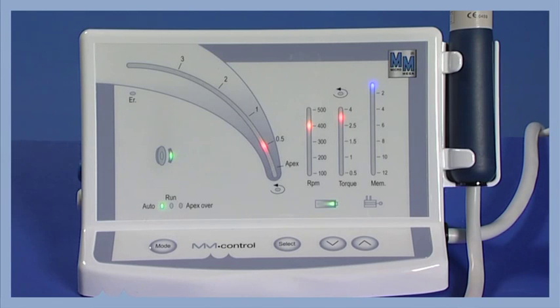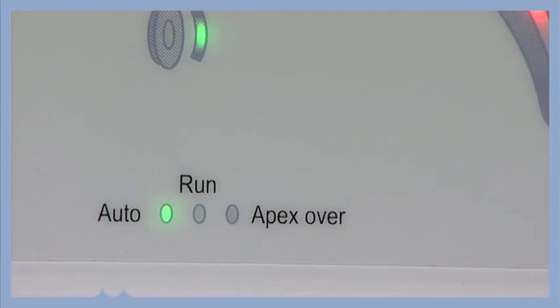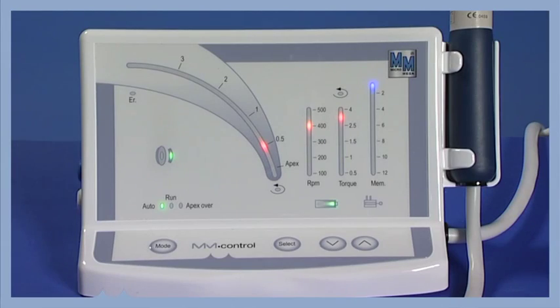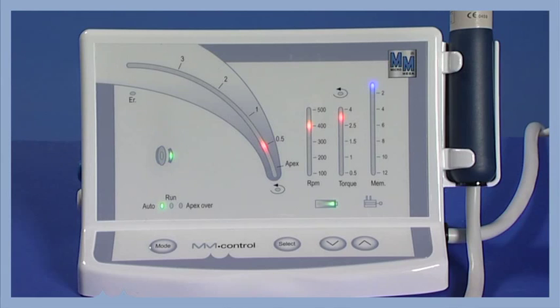The MMControl features three operating modes. In Auto Mode, the instrument starts automatically when entering the canal. It goes into Auto Reverse when the set torque or apical distance is reached and stops automatically when the instrument is out of the canal.